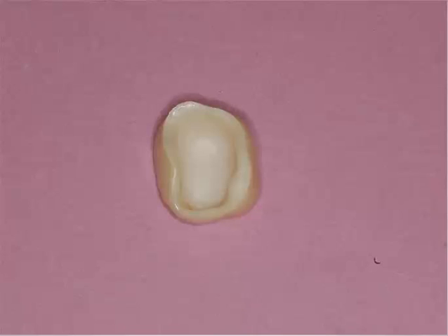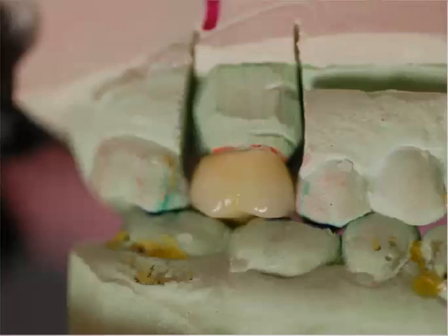You look at various studies. The CAD-CAM restorations or all-ceramic press restorations really have a better track record than our traditional porcelain fused to metal as far as success rate. And obviously they're very esthetic. But you can see the sharp margination that I'm able to create from the impression because of the CAD-CAM, computer-aided design, computer-aided manufacture, or milled. We have an internal coping which is milled, shaded, and then I like to veneer these. I like to layer on top of these copings to give a nice natural end result. You can make these in monolithic form like the Bruxir.